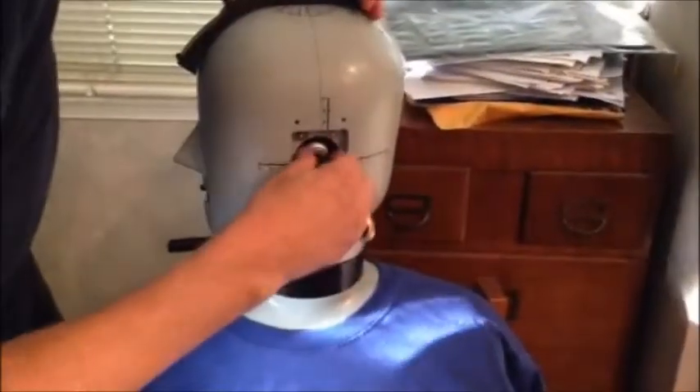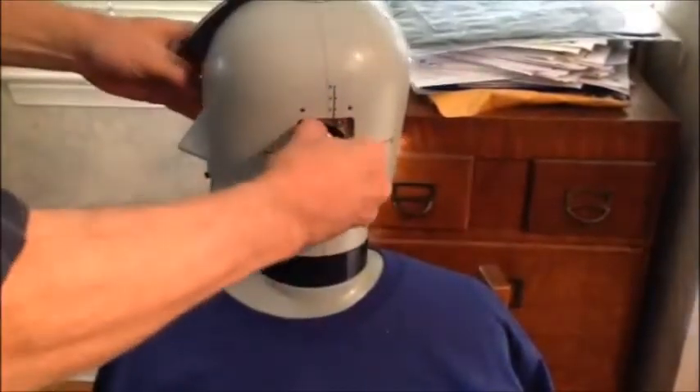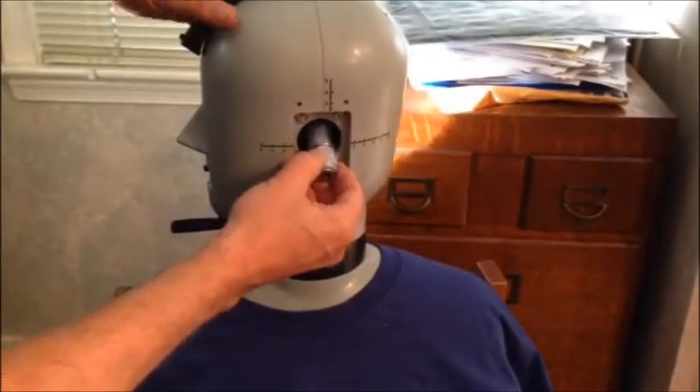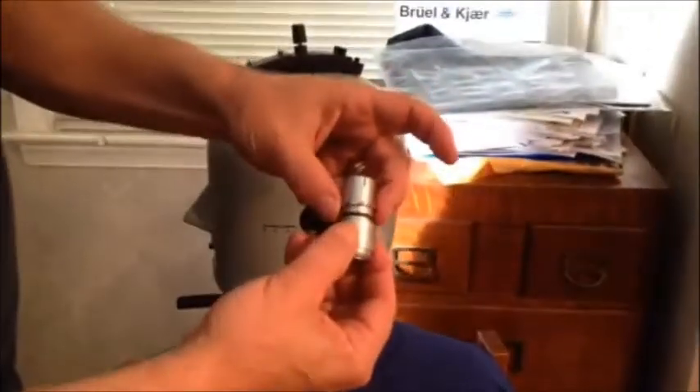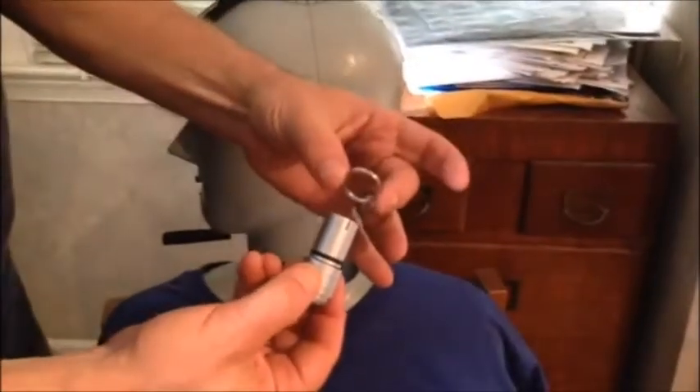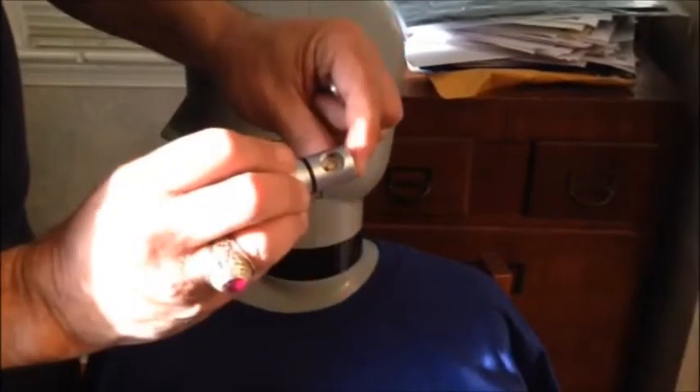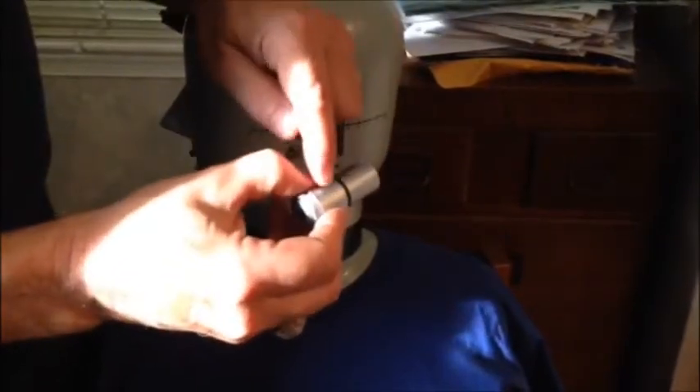Put that aside for the moment. Now the coupler will come out along with a spacer ring for sealing and the right angle adapter that allows the vertical preamp to attach to the horizontal coupler. That can be separated by unscrewing.